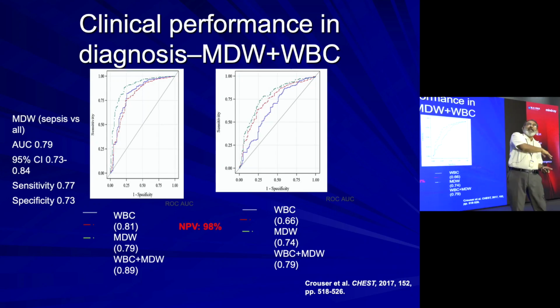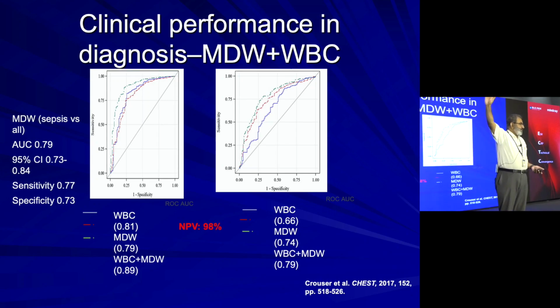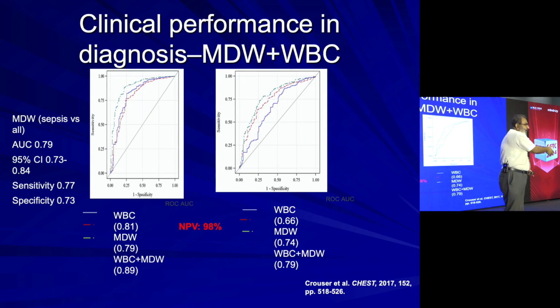She doesn't look at the histogram, she only looks at the scatter plot. So I told her, please look at the histogram. If MDW is there, MDW should be in the histogram also. It's not there in the histogram. Her husband is a very good biostatistician, so she can convert anything into statistical significance.